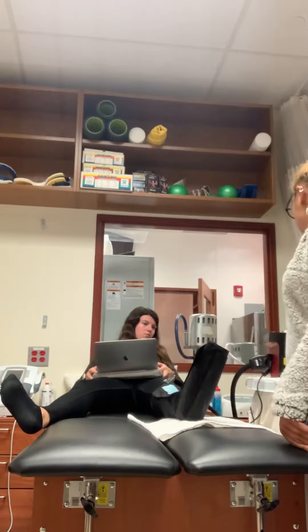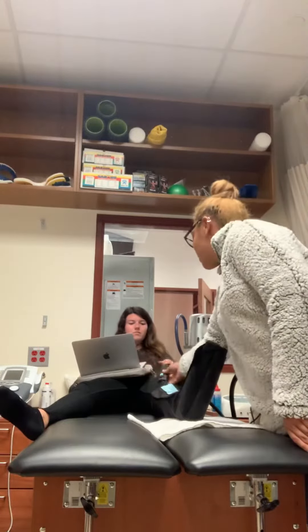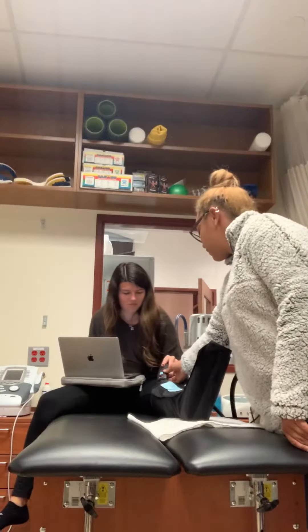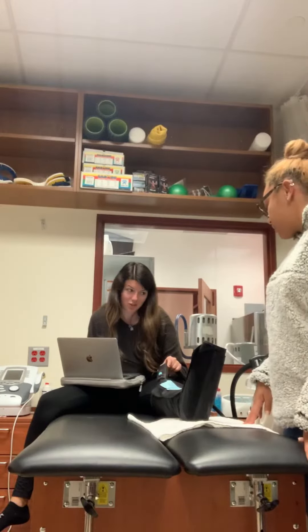So what we're going to do is press start. It's going to start filling up — hopefully it doesn't leak today. Is it filling? How do you feel? It's going, it's not leaking, which is good.